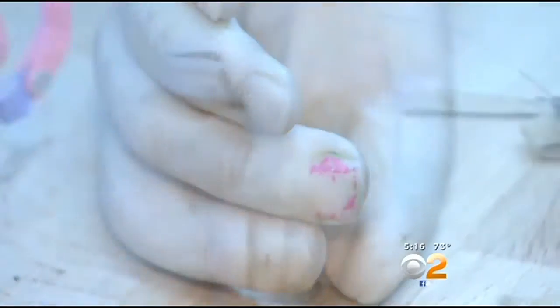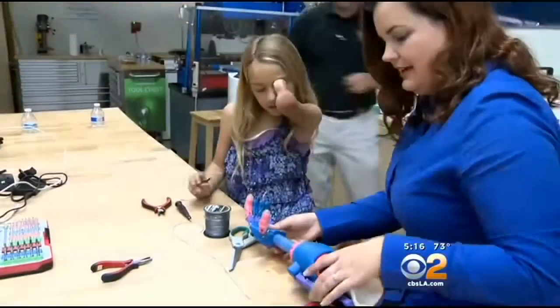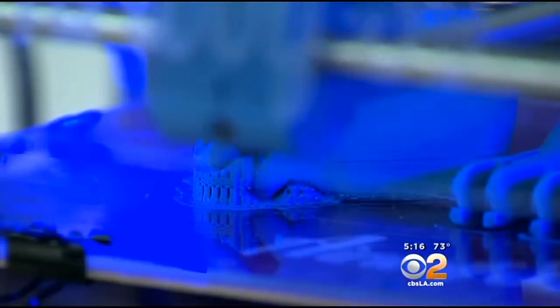Faith tried various prosthetic hands over the years, but they were either too stiff or too bulky. And then her mom found the engineers at Build-It Workspace in Los Alamitos, home to a 3D printer. "We've never tried it as a prosthetic before, and so this was part of the excitement of it all."